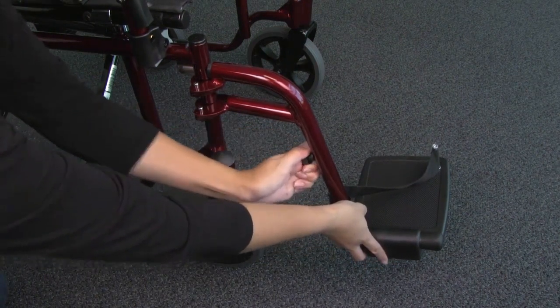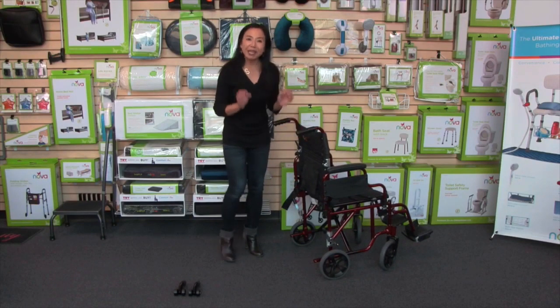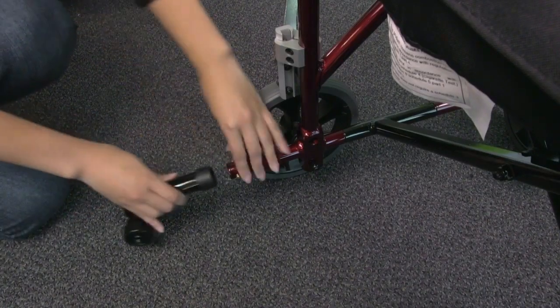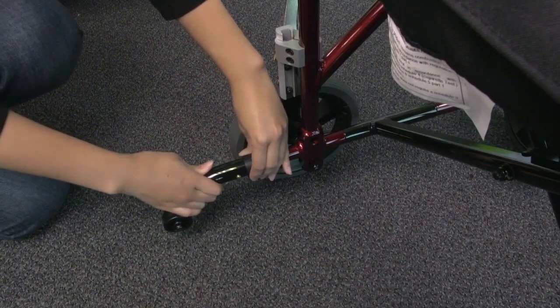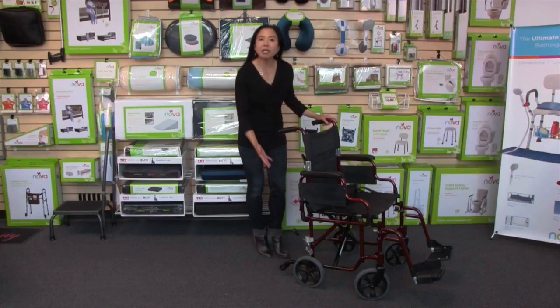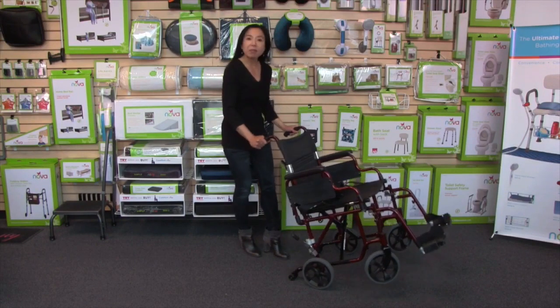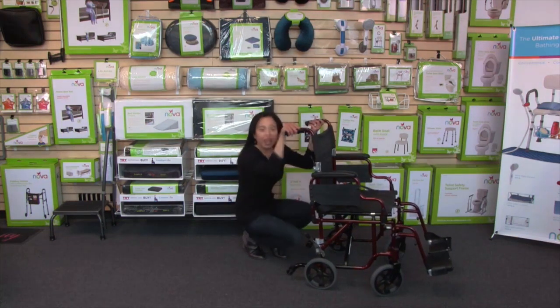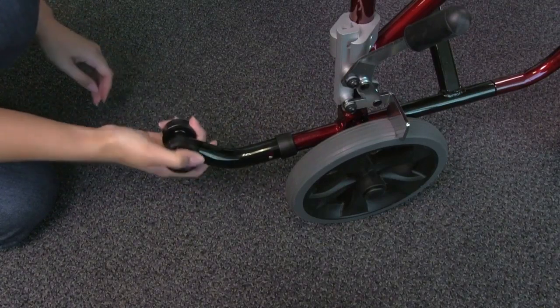Another unique feature is that this transport chair comes with anti-tippers, and they're so easy to install. You just insert them into the back tube, and you'll notice there are two brass push buttons that are going to pop out through the holes. The purpose of these anti-tippers is to prevent the transport chair from tipping back — it's a great safety feature. You can also adjust them so they are out of place if you don't want them in use.